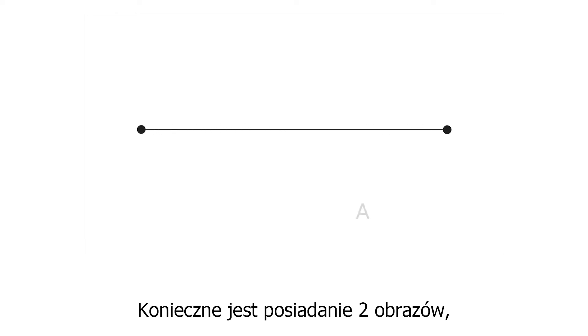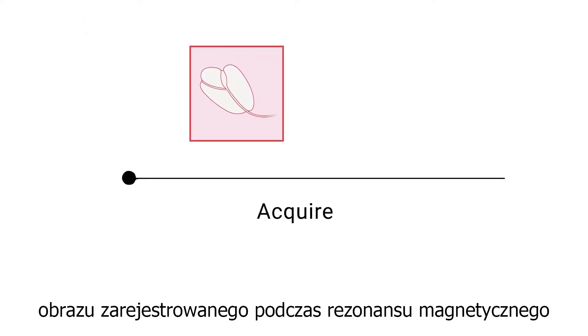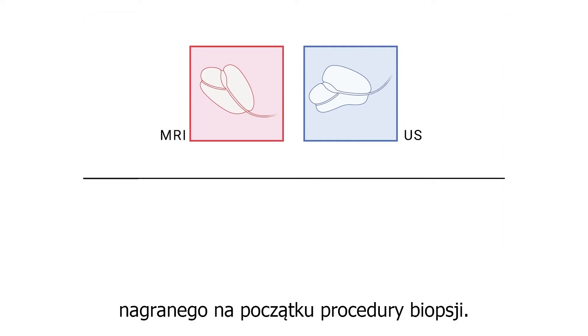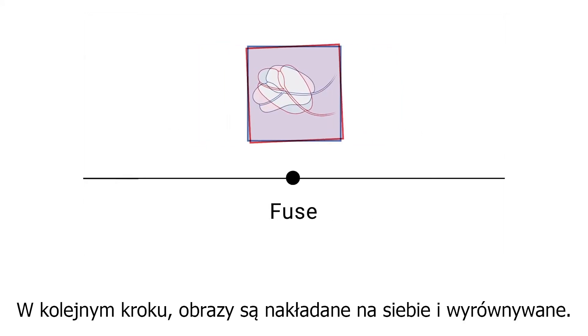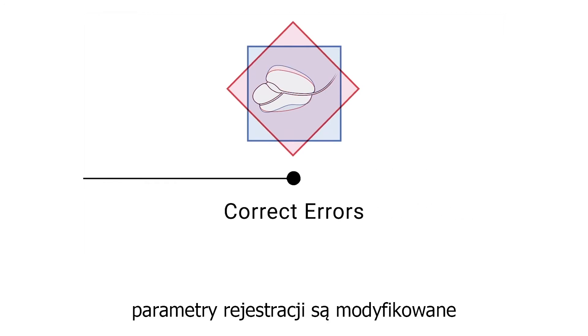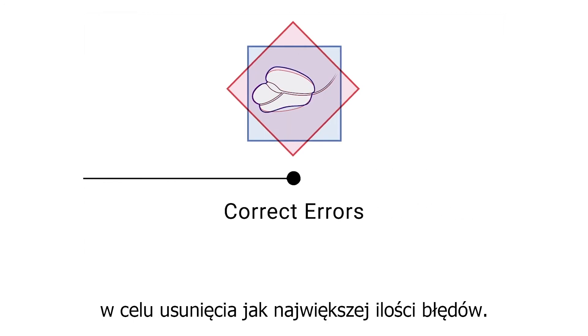First, two images are required — in this case an MRI before the biopsy and an ultrasound at the beginning of the biopsy procedure. These images are then fused and aligned to each other. During the final alignment stage, registration parameters are adjusted until as many errors are corrected as possible.